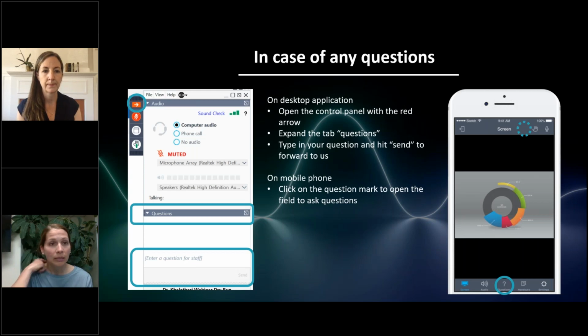Thank you. Next question is, have you considered trying to combine the photopic negative response and pupil response work together for a better diagnostic performance? I thought this as well while you were giving your presentation. Right, because it's the same device, so you could have a program there. In fact, we have to short circuit the electrode because the device requires that you have an electrode connected, so we have to confuse it that there is one there even though we don't care.